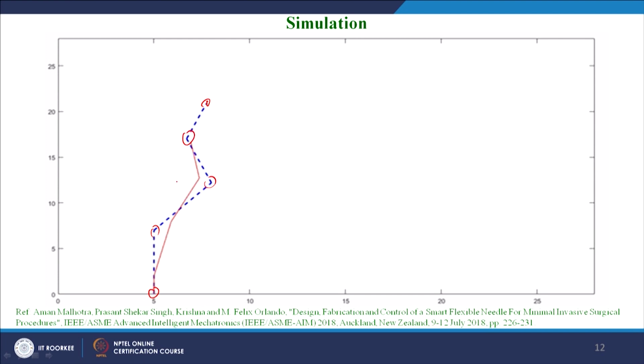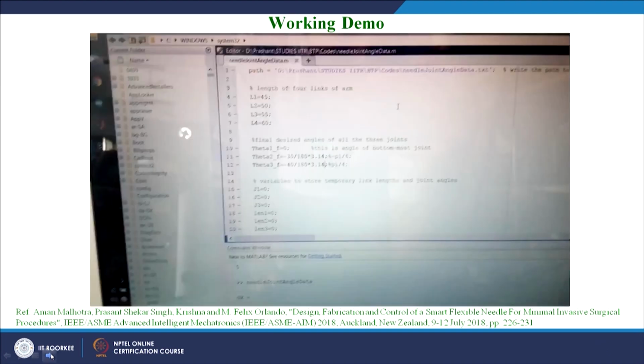It is getting pushed by the first degree of freedom, which is the prismatic joint D1. As you can see here, it gets set with the first joint angle, second joint angle and third joint angle, and finally it gets into the shape of that desired trajectory.